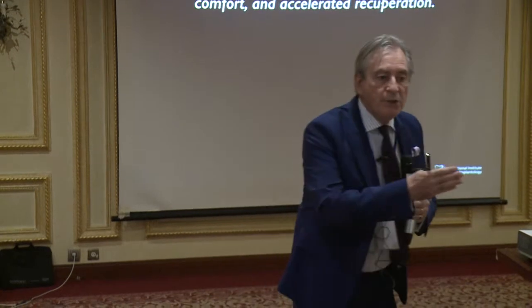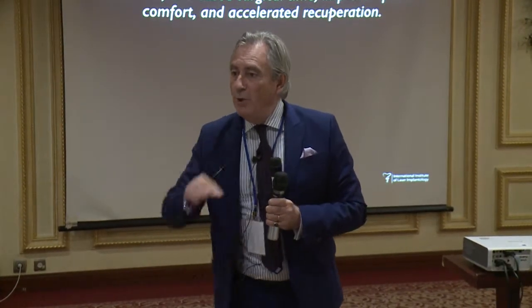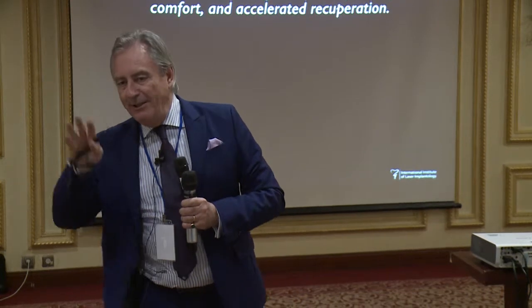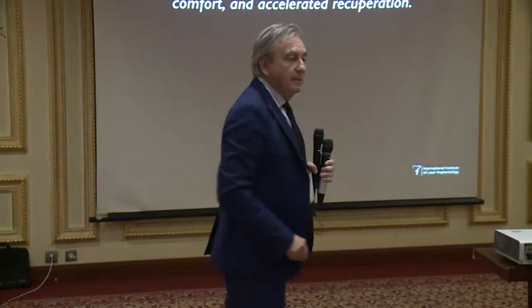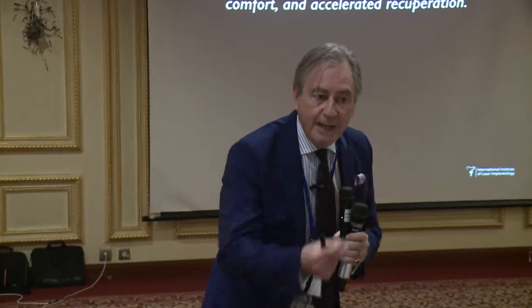And this is because in guided implant surgery we're working flapless that we have good results. Actually, that's another topic. I'm not that sure that there are so good results that this has been demonstrated. Anyway, it comes because of the preservation of the circulation, the preservation of this blood supply, which is fundamental.